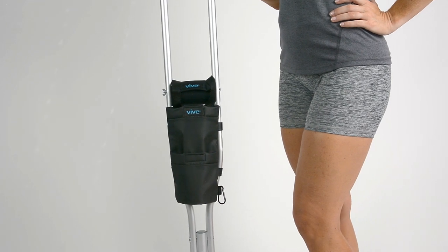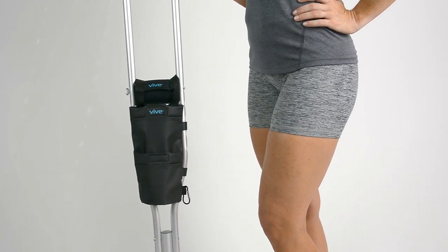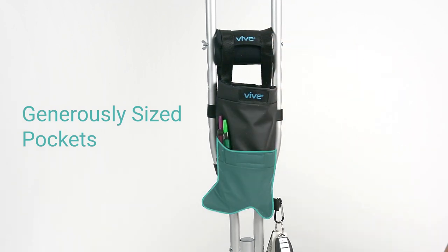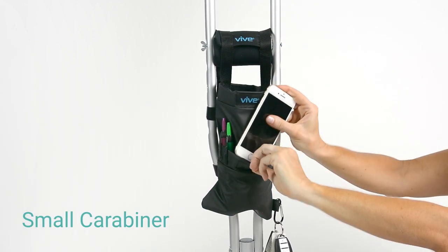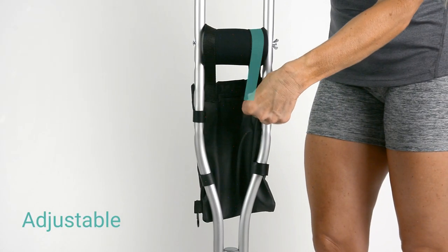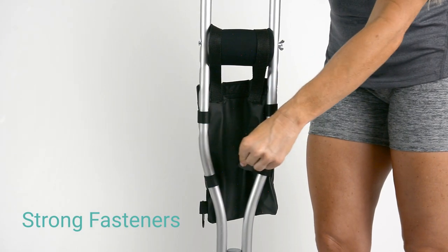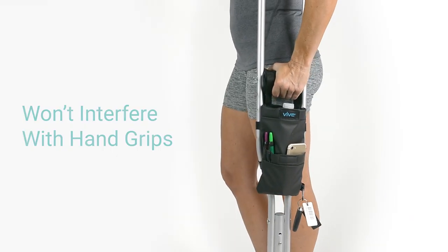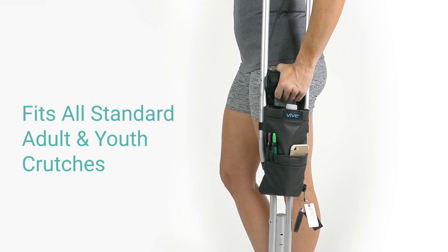The Crutch Bag by Vive safely and securely carries your everyday essentials. Generously sized pockets hold items such as a wallet or water bottle, while a small detachable carabiner secures ringed items like your keys. Two adjustable vertical straps and four side loops attach to crutches with strong fasteners. Pouch placement will not interfere with hand grips, and the versatile design fits all standard adult and youth crutches.